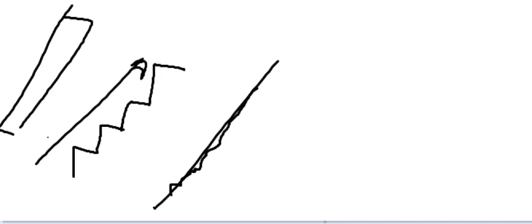The slice thickness depends on what? On the detector thickness. If the detector is 1 centimeter thick, it will not be able to detect a 1 millimeter stone. Do we get the idea? If the detector is thick, it will not be able to detect small things. You cannot make a slice thickness of 1 millimeter if your detector is 5 millimeters thick, because it will see every 5 millimeters together. If your detector itself is 1 millimeter thick, it will see every 1 millimeter, 1 millimeter, 1 millimeter. Get it?